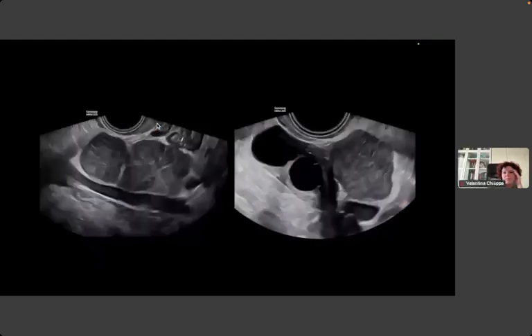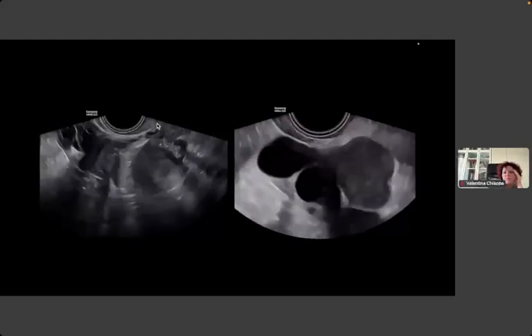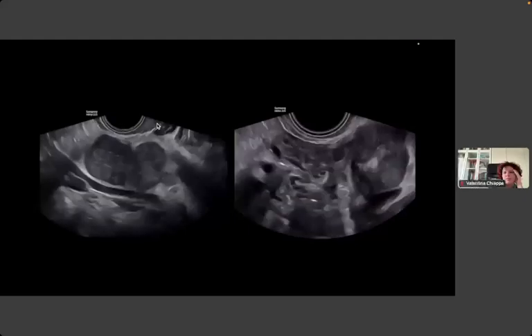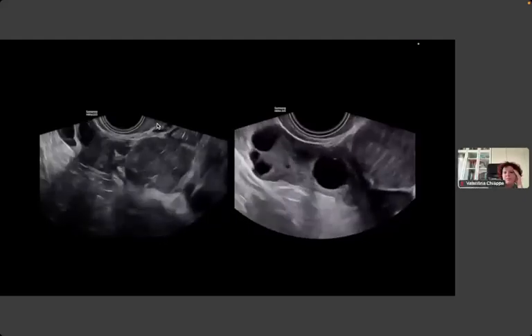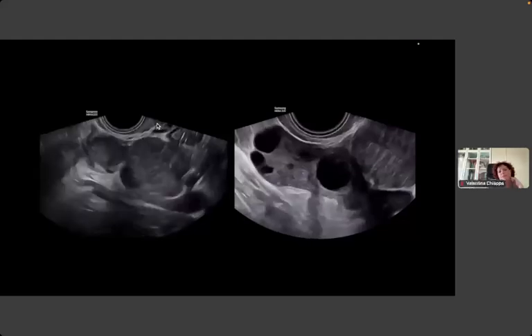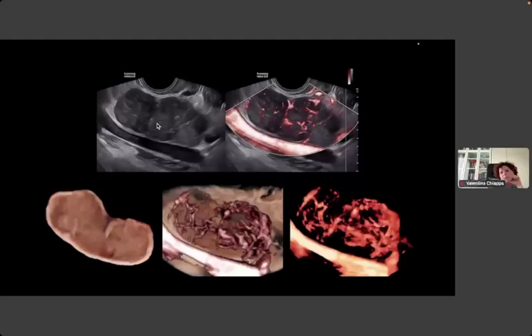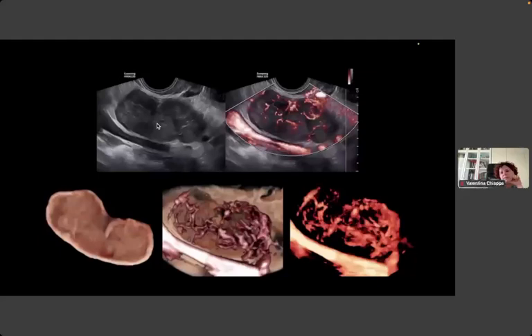In this other case of tubal cancer, the solid lesion can be clearly separated from the ovary by applying a gentle pressure with the probe. We can see how the solid lesion appears richly vascularized with a color score 4, and thanks to 3D rendering with a realistic and crystal view and 3D rendering power Doppler, we can appreciate its appearance.